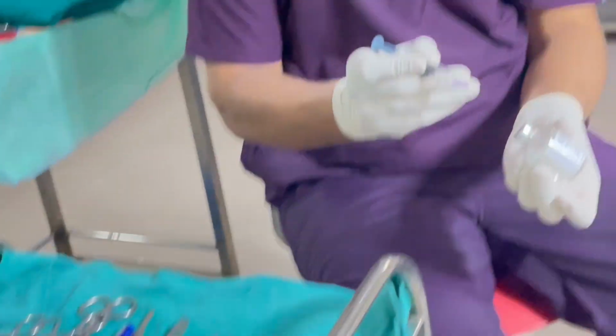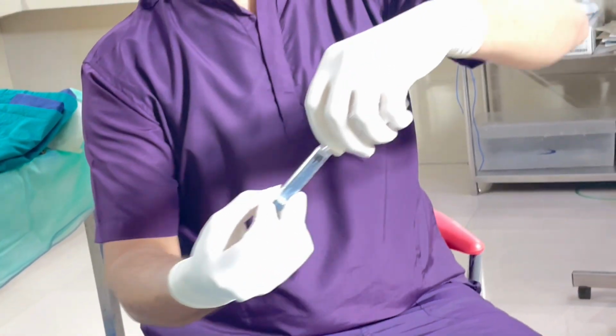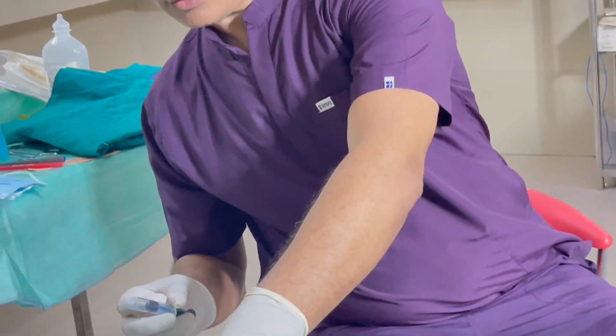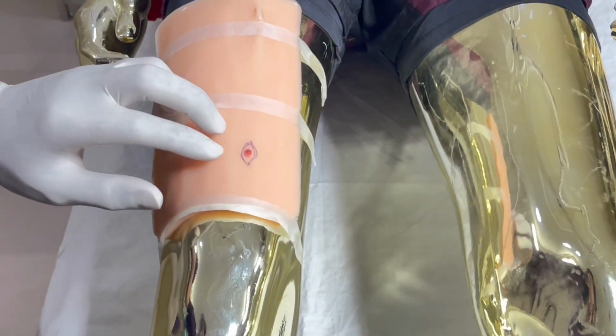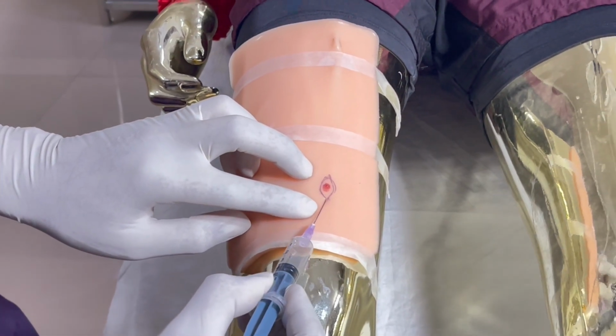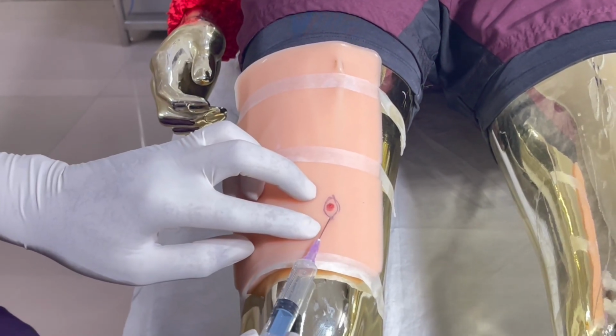So this is a needle. I will just withdraw the local anesthetic with this. Then I discard this needle into the waste and use a 25 gauge, very small needle. This is a 25 gauge small needle. Ms. Smith, you will be getting a small scratching pain. I will just be injecting this numbing agent. So first prick you will feel a little. I will just aspirate and see whether blood is there.